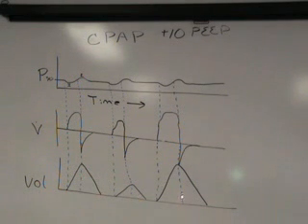Volumes can vary depending upon how much the person's inhaling. Flow can vary depending upon how hard the person is pulling. But my pressure scalar should stay right around my PEEP level, because the ventilator will open and close those inspiratory and expiratory valves. Therefore, if I were to explain this, there's nothing really to trigger, there's nothing to limit, and there's nothing to cycle, because there's no breaths to describe. This is simply a patient breathing at an elevated baseline.